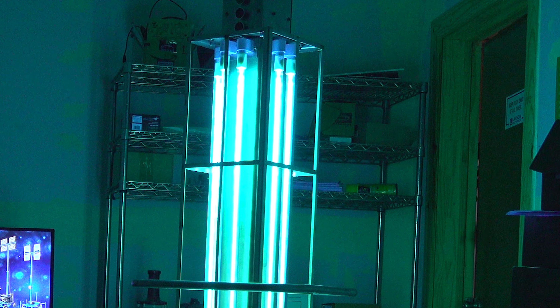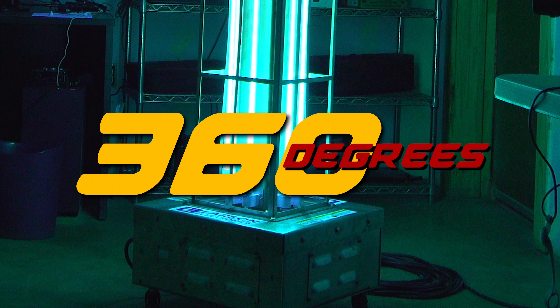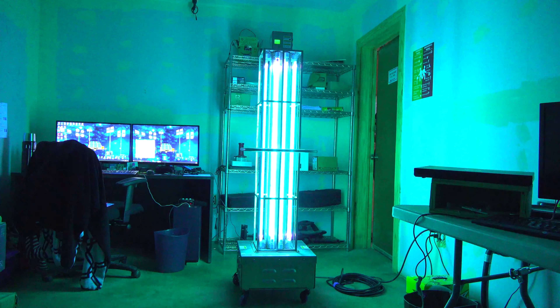Standard models in this series feature vertical UV lamps that provide full 360 degrees of coverage. Motion sensors make disinfection safer by automatically turning off the system upon sensing movement in the surrounding area.